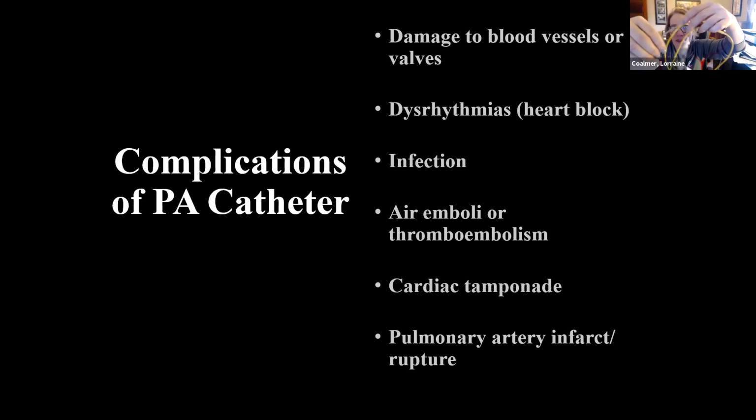All right, and then this port, that's the pulmonary artery pressure. And here's the beauty of this one. It says it right there. It says PA distal. That's the port that we connect pressurized tubing to get a pulmonary artery pressure reading. And then last, we talked about that CVP, or right atrial pressure. See the blue? And remember the blue stickers on the claw today? This is where we would get the right atrial pressure, and it's also the port where we inject for cardiac outputs.